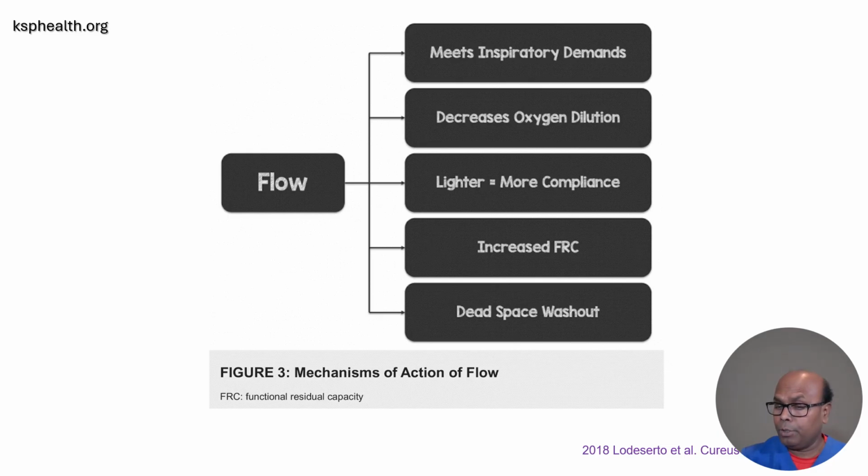It also increases the functional residual capacity. It also causes another thing called dead space washout. Let me explain what dead space washout is. When you breathe in, you take atmospheric air with 21% FiO2. When you expire, you breathe out carbon dioxide.